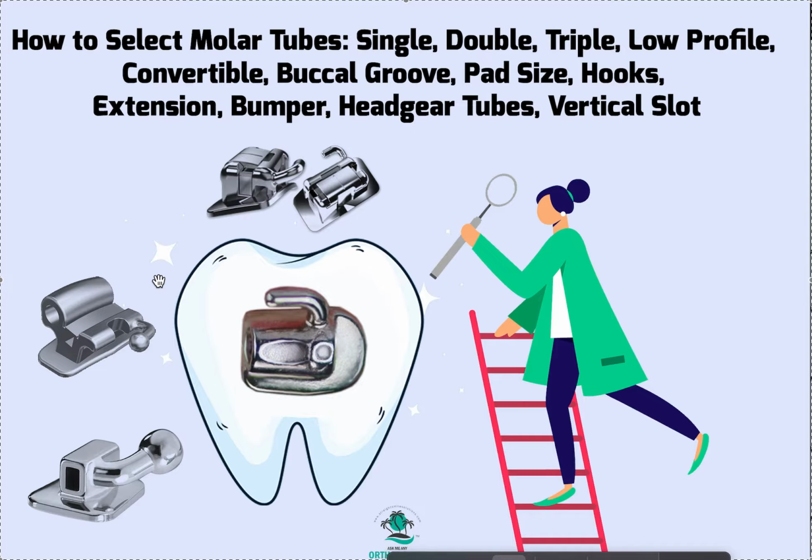We're getting really complicated. All this funky stuff is from when I was trained by Burstone Mechanics. It's really cool what they taught us, how to move things, but it was the most inefficient way of moving things. But you learned all about the forces, right? It's basic physics bent into wires and cantilevers and auxiliaries. But we used a lot of these convertible tubes, triples, and things like that.